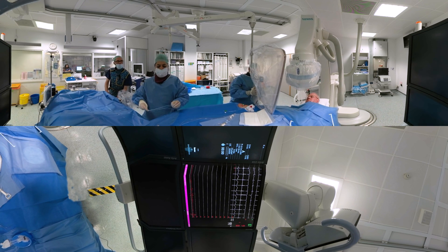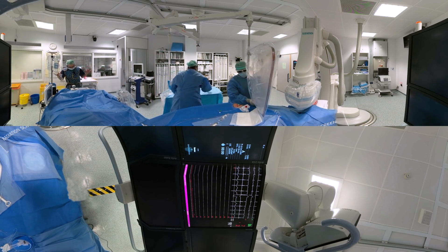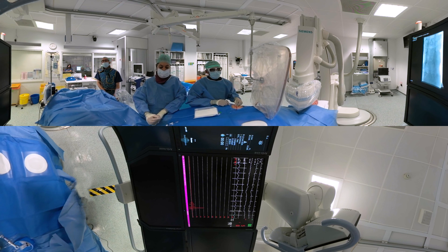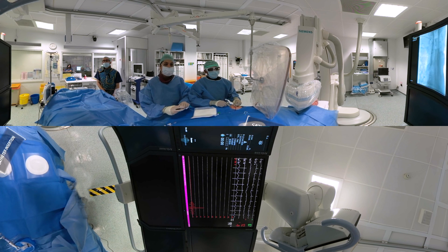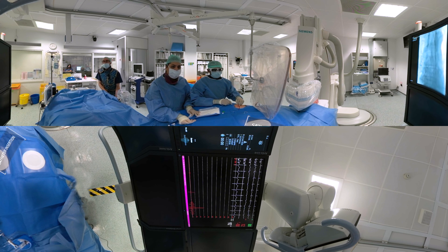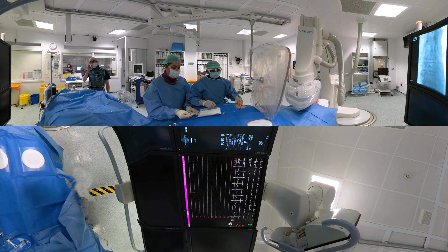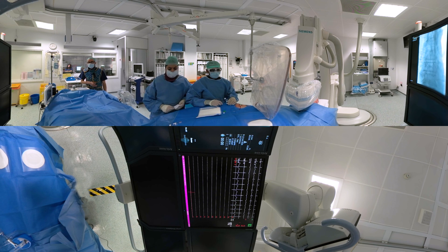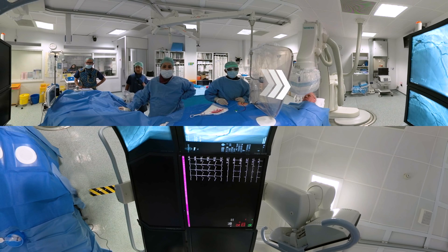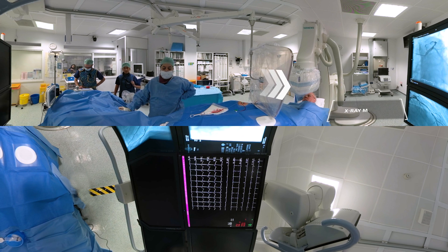This shield protects us from the radiation because we're here every day. I can now use the x-rays to see where the wire's going. The wire's passing into the aorta, which is the main artery, and this catheter follows the wire. So I'm just going to show you these pictures and show you what I think the problem is.